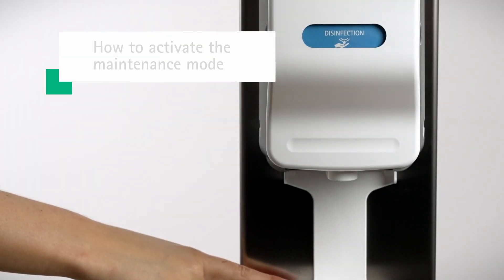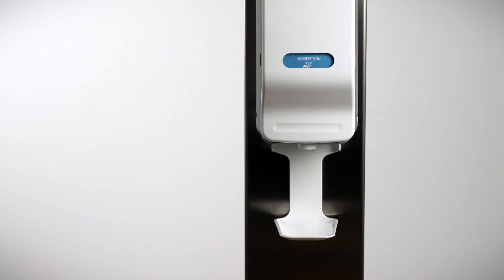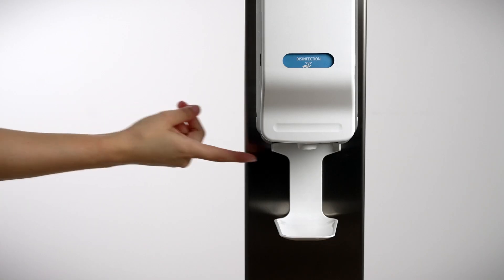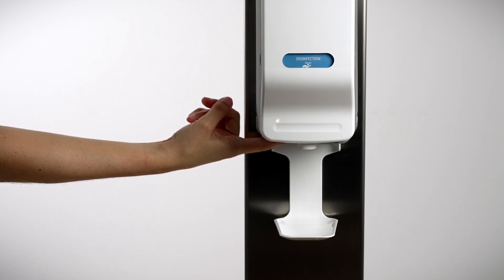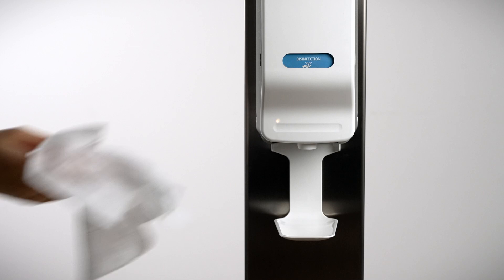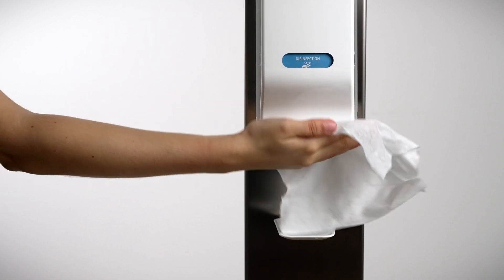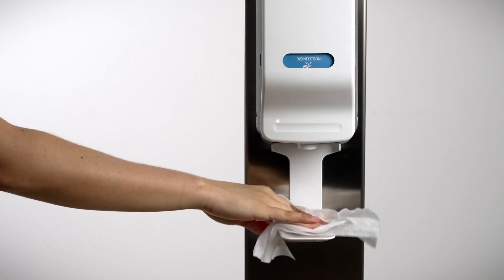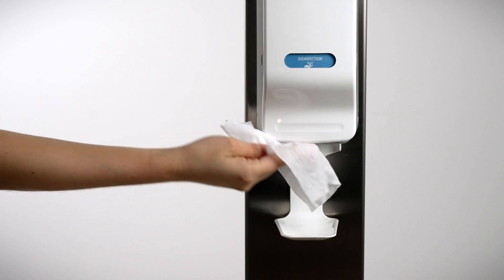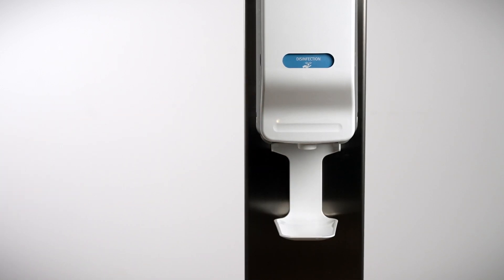In order to clean the area underneath the dispenser, there is a cleaning function which stops the product dosing for 30 seconds. With the cover closed, press the operating button underneath the dispenser once. The dispenser is then inactivated for 30 seconds to allow you to clean the device and the area underneath the dispenser. For 25 seconds a yellow light is constantly on, and in the last 5 seconds the yellow light will flash to give you an indication of the time. The system is automatically ready to operate again afterward.